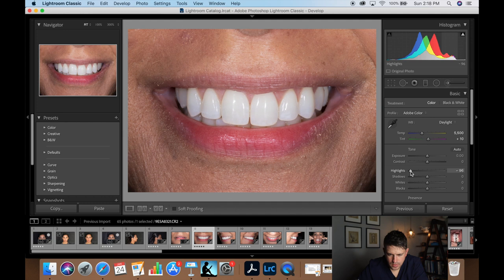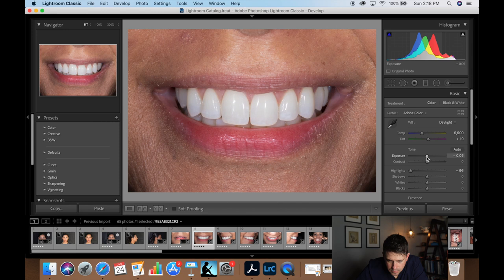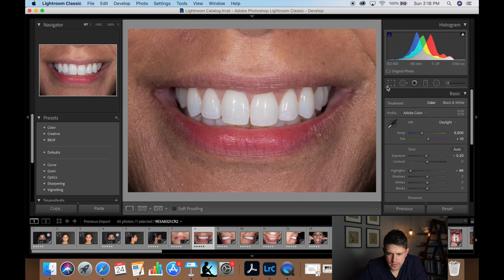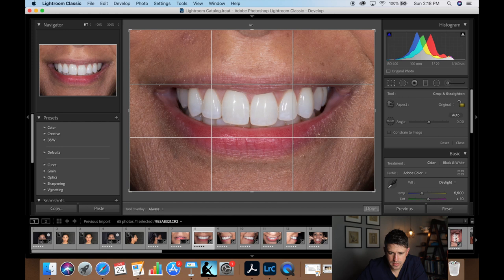Again a little overexposed so let's take the highlights down. This computer processes a little slower than my other one so there's a bit of a delay. Let's make sure the commissures are fairly even — that actually looks pretty good so we're going to leave that as is.